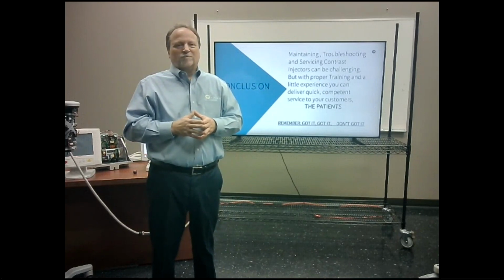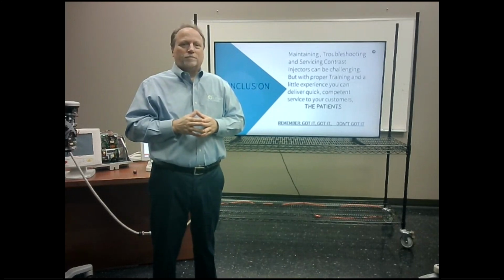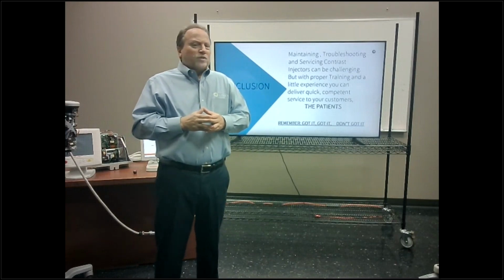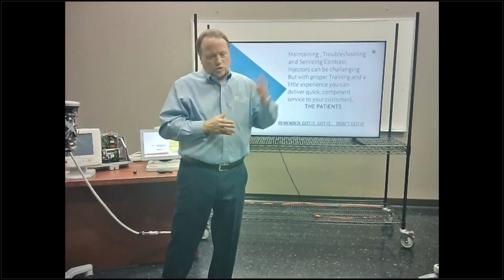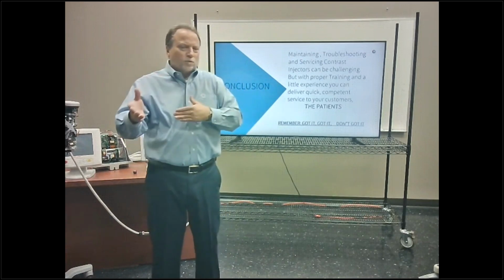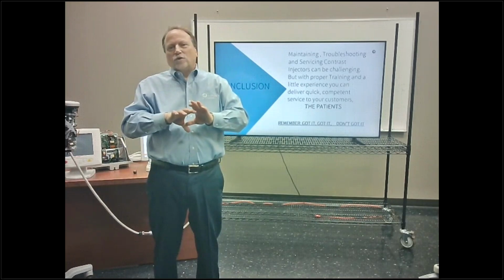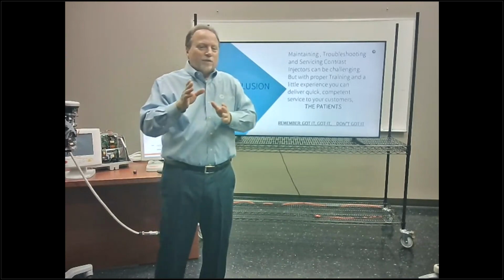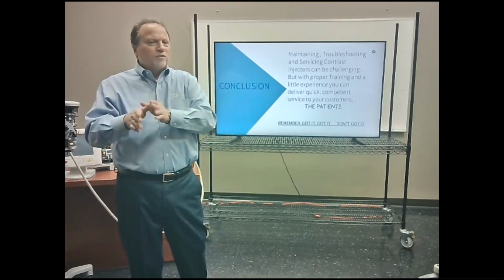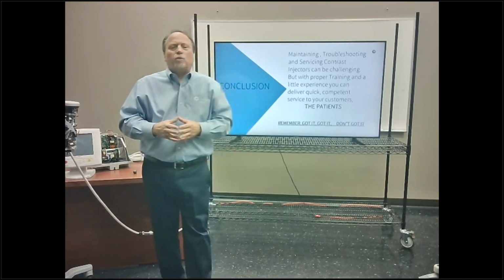All right, our next question is, when looking at the error codes and possible causes, how accurate are the probable causes? I would say it gets you in the ballpark, and that is why when I was mentioning the troubleshooting, what works, what doesn't work. What are all the symptoms I have, and if I can put together what is actually working on everything, I can narrow it down to say, okay, if this is working, even though it's giving me the error, I can see that it's working, then there's something else. So it gets you in the ballpark.